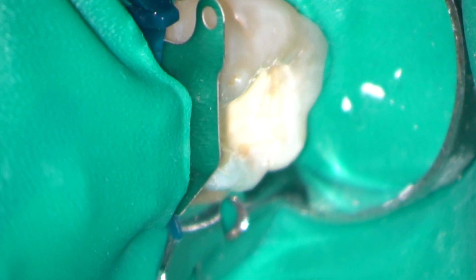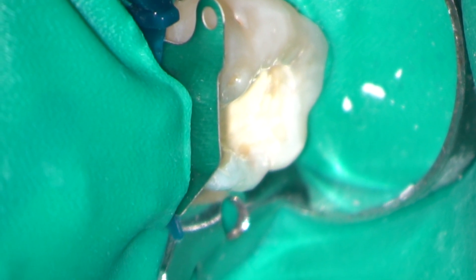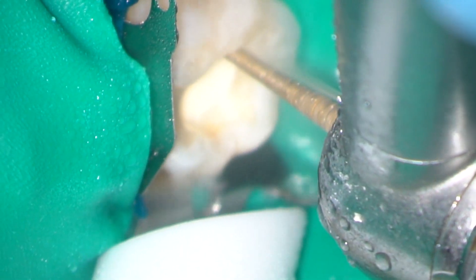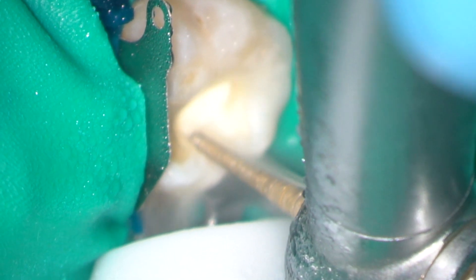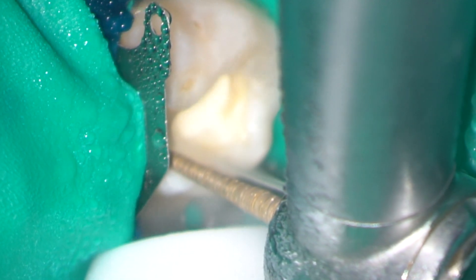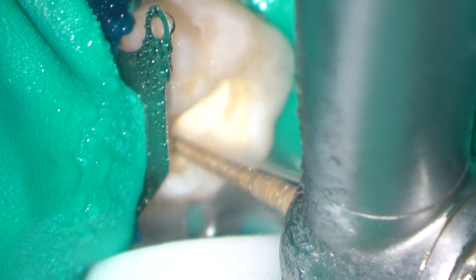After about 10 minutes the biodentine is set. I've placed a palodent wedge between the teeth and I'm now removing the remaining composite and tidying up the margins of the cavity. This will then be sealed using a full etch, bond and light cured composite restoration.